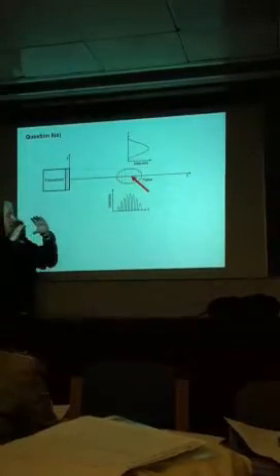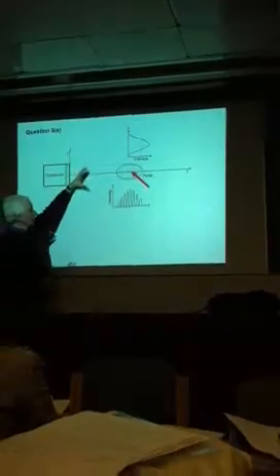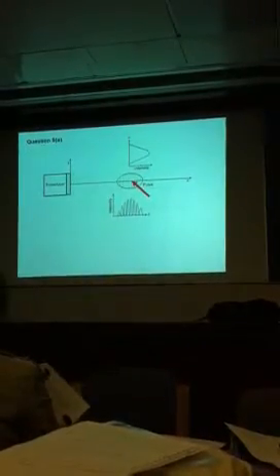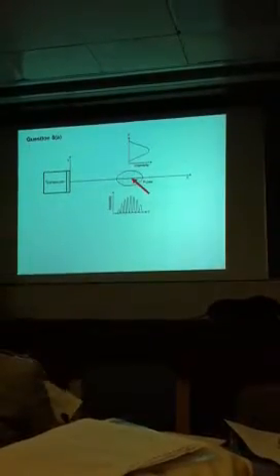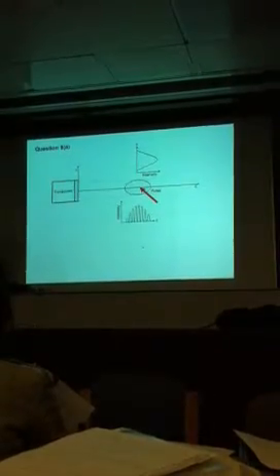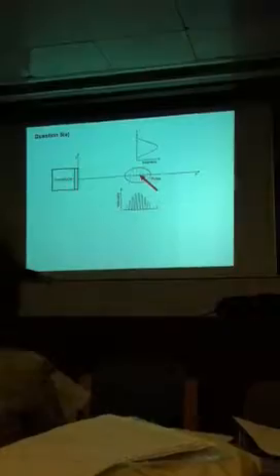They might be increasing and decreasing in size as they travel. Due to this focusing here, these little discs become shorter, then they become broader again. That's the mental image you need to carry in your head of what a pulse profile looks like. Now, from a safety point of view, if we want to calculate the maximum intensity that I might be subjecting my patient to at this point, then you need to take into account that there is this quite complicated profile.